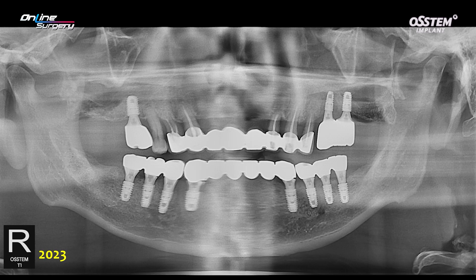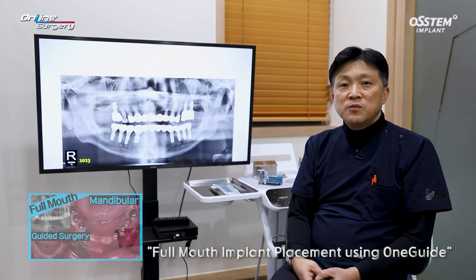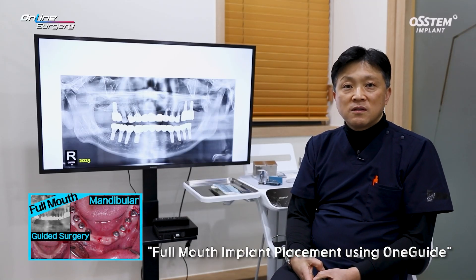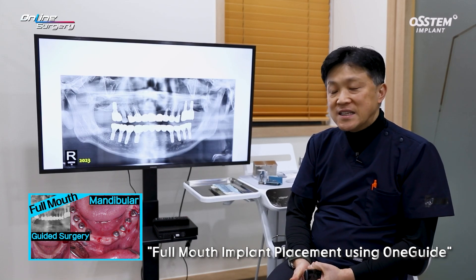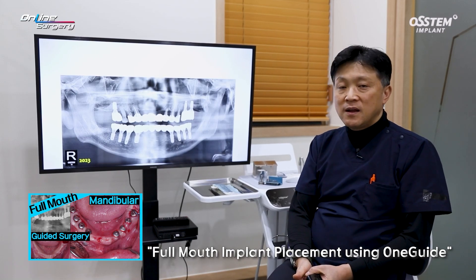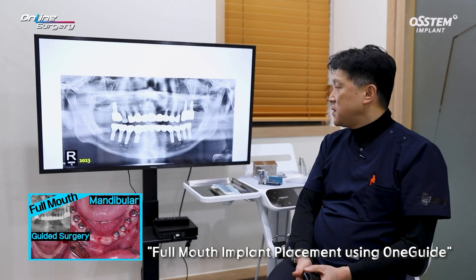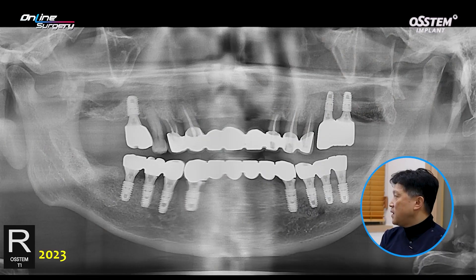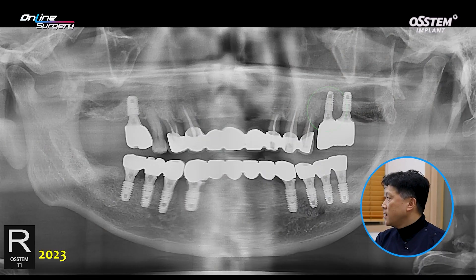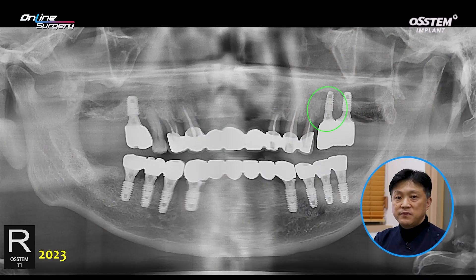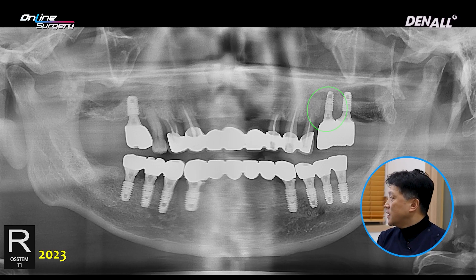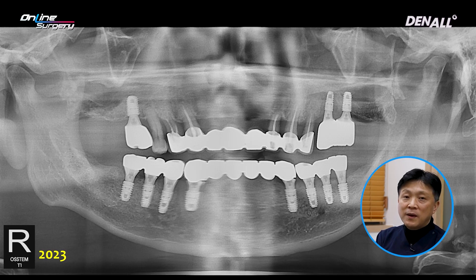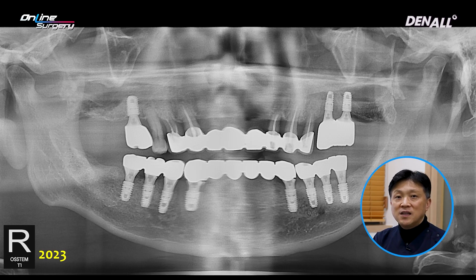Implants were placed. This case was introduced previously via online surgery. Upon follow-up in the upper left area, among the two implants placed, periimplantitis erupted in the mesial implant and the severity was over-moderate.